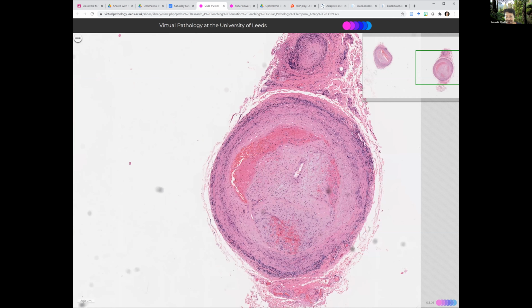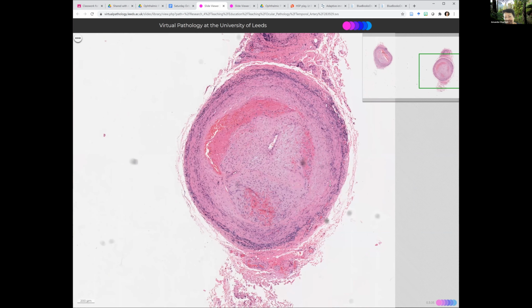Blood vessels come in arteries and veins. The other thing that would support this being a blood vessel is that this is a branch of the larger blood vessel. They're both seen in transverse section. Is it an artery or a vein? I can see at this power down here some pink wiggly worms. This is the internal elastic lamina. Therefore, I think this is an artery. Here we go.